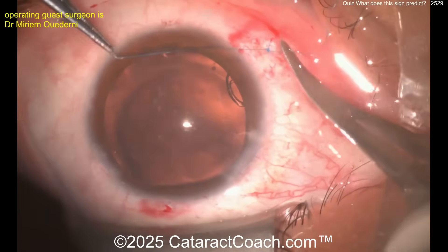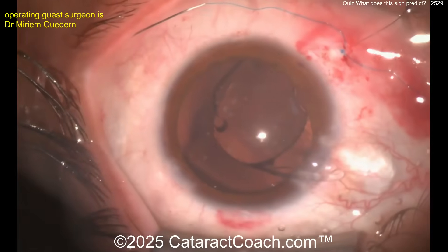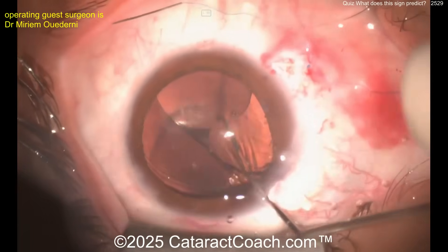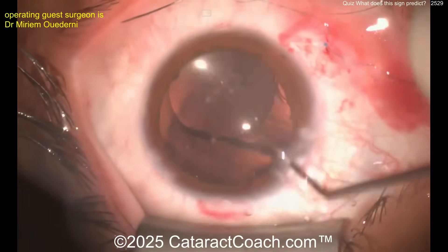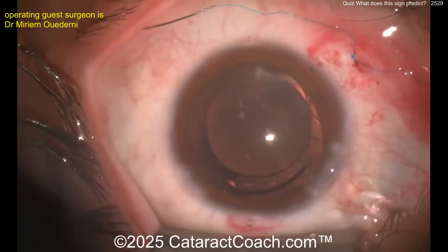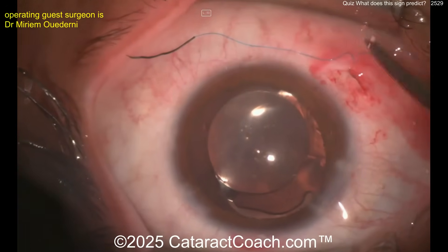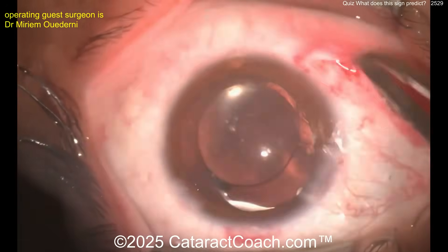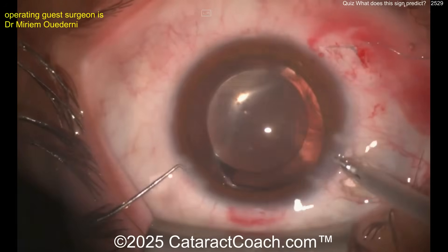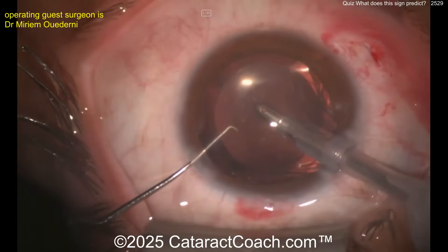There's the knot tied up nicely. Get that knot rotated inside — here comes a single piece acrylic lens going in the capsular bag. The IOL is in the bag, get the haptics in the bag as well. Now you've got that knot being pushed inside the sclera, which is good — the suture itself is within that groove, which is great. Rotating the knot, pushing it inside — beautiful. Now, do you need to secure the other side or not?